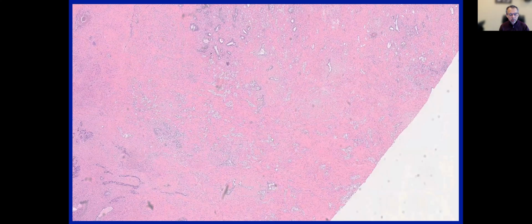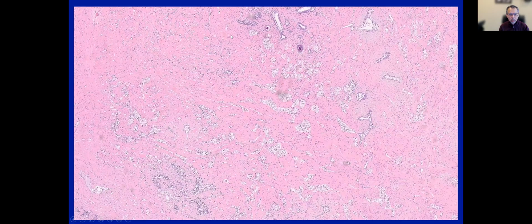This is a scanning magnification image, and as you can see here, there is a cellular infiltrate of somewhat clear-appearing cells in cords, small nests, and poorly formed glands, and it appears to be clearly an infiltrative process, as you can see all around these benign glands. Seeing them a little closely, I think there is a distinct clear cell change within these nests, cords and poorly formed glands. There are also numerous single cells that you can identify. Some of them almost look like lymphocyte-like nuclei.